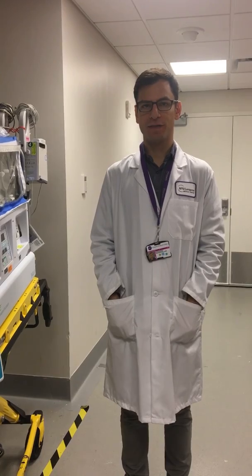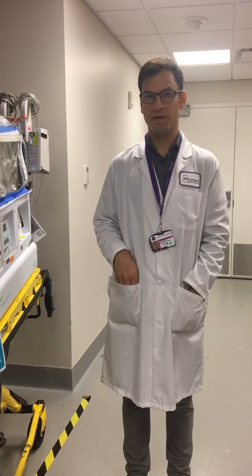Hi, welcome to an NYU Respiratory Department neonatal transportation video. We're going to discuss high frequency ventilation transportation with nitric oxide.